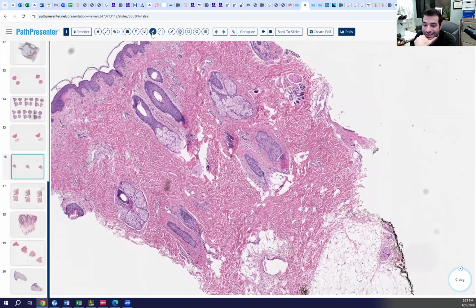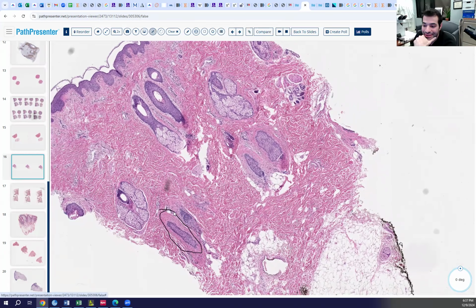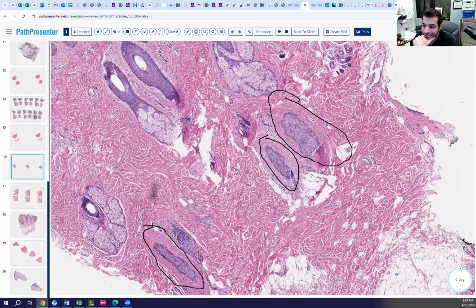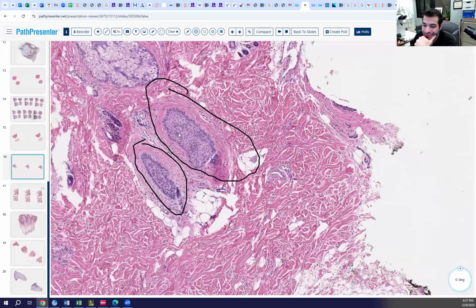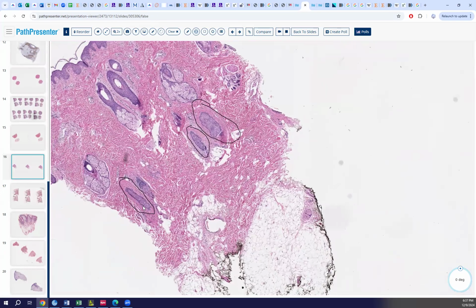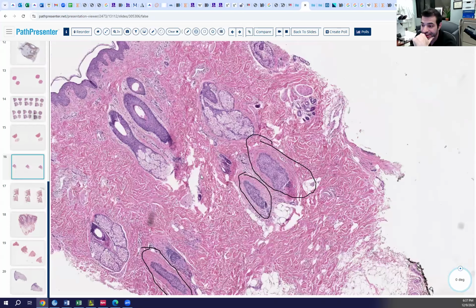So where are our hairs? Gone, but not totally gone. I mean, this is eaten up. Now there's other hairs here, obviously, and they're miniaturized. But what's going on here? What phase are these hairs in? This doesn't look like a flamethrower, and that's what points me to telogen. Okay, so a telogen shift.